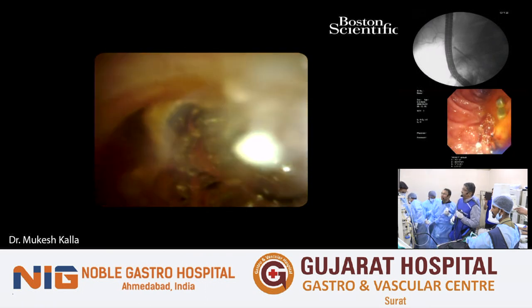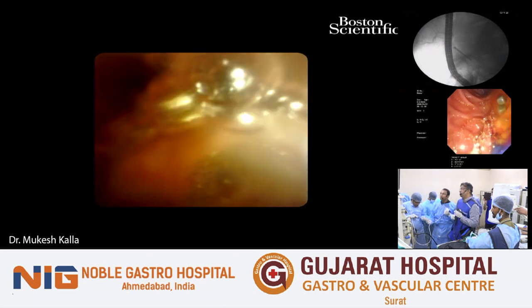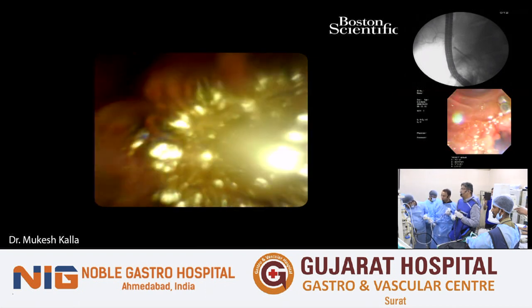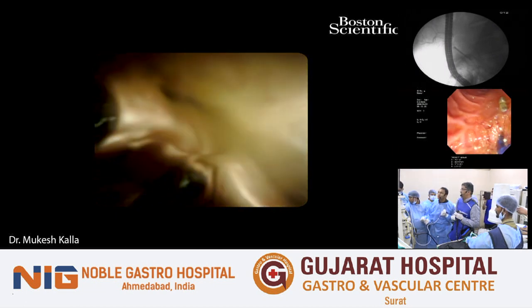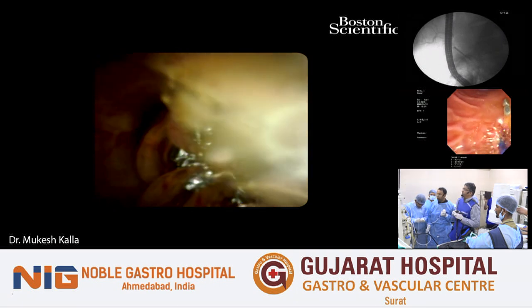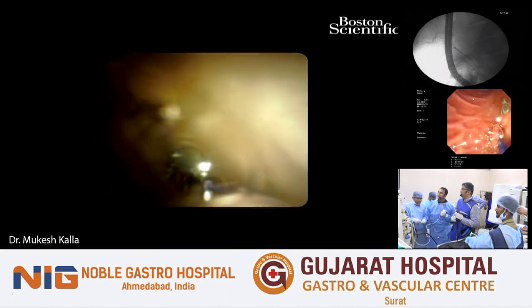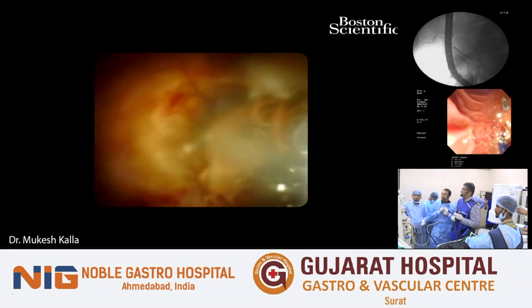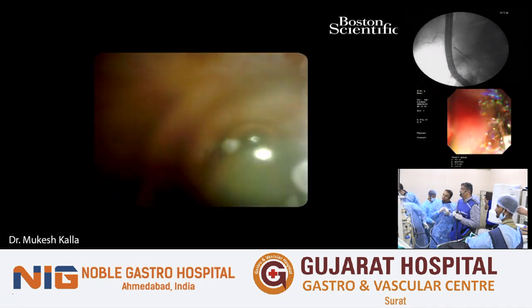Now there are two important things. One is irrigation. What I personally do while irrigating these patients, as we all know that cholangioscopy has a 3.4% incidence of cholangitis, and probably this irrigation may be one of the responsible causes, is to keep it at the lowest possible flows. And when you have a large stone, and you are doing EHL or laser lithotripsy for large stones, a lot of water gets flushed, and these patients are prone to aspiration. So I don't do it in intubation status. We just do it with propofol anesthesia. So I would come in between and make sure that there is not enough water in the stomach, which causes aspiration.